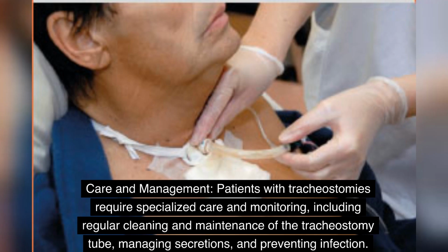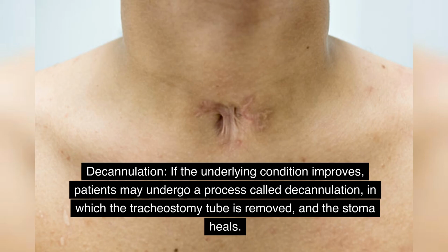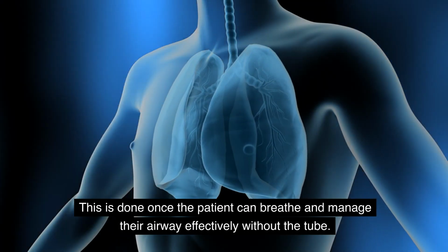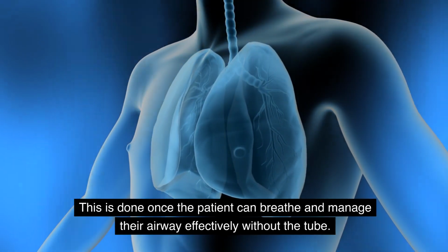Care and management. Patients with tracheostomies require specialized care and monitoring, including regular cleaning and maintenance of the tracheostomy tube, managing secretions, and preventing infection. Suctioning and humidification may also be necessary. Decannulation. If the underlying condition improves, patients may undergo a process called decannulation, in which the tracheostomy tube is removed and the stoma heals. This is done once the patient can breathe and manage their airway effectively without the tube.